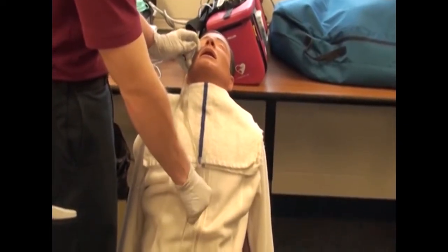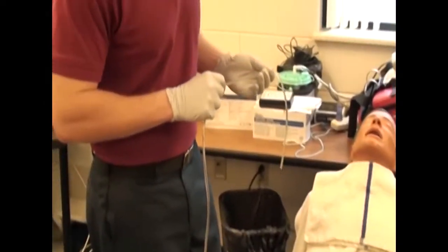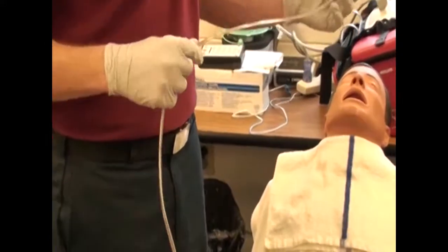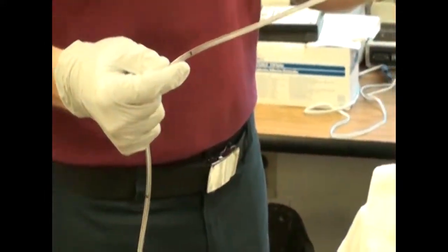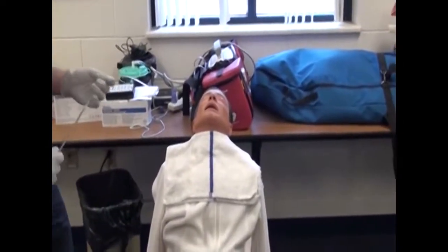Mark length of tube to be inserted with a piece of tape or note distance of point from next to marking. Show me the mark. Just show me the mark on the camera. Okay. Instruct client to extend neck back against pillow.